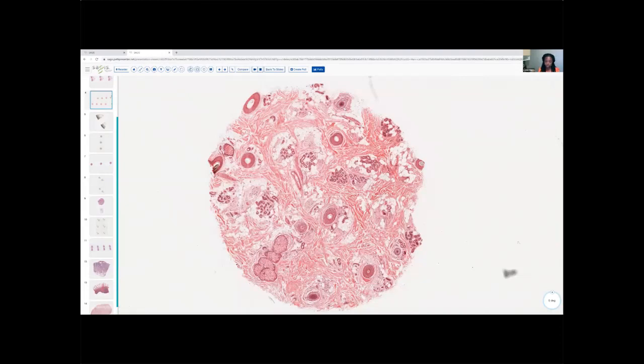If we try and look for miniaturization when we're up, for example, in the infundibulum or isthmic zone, well, you know what, we are probably going to see some variation, but that's not unexpected, because remember, even the scalp does have some portion of hairs that are going to be vellus hairs.